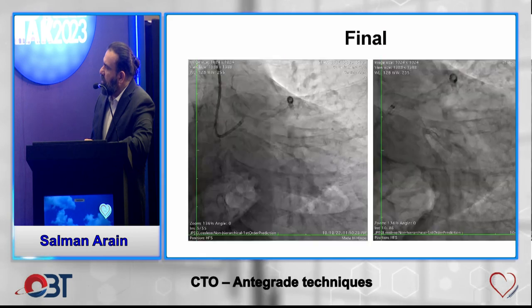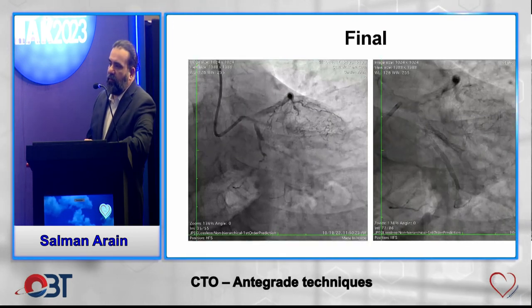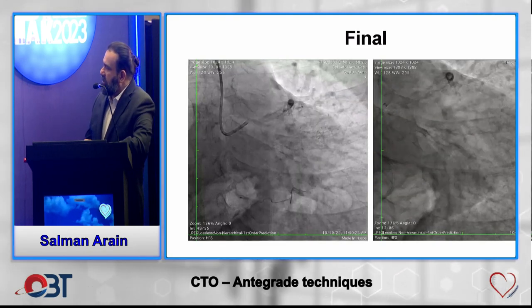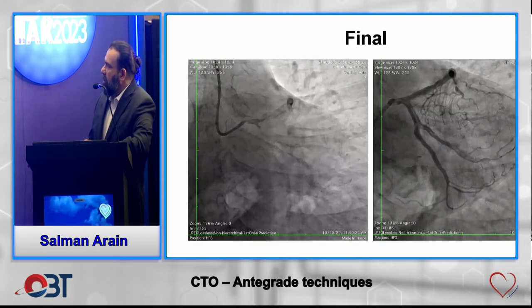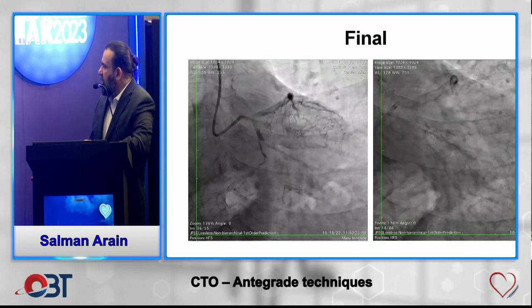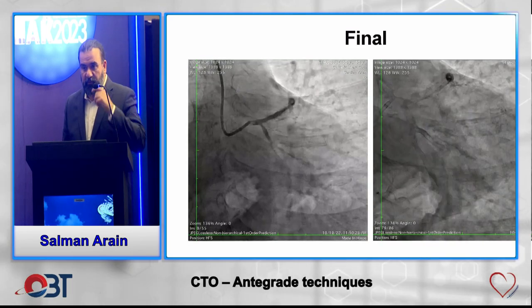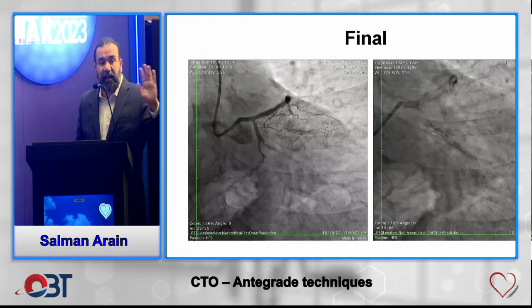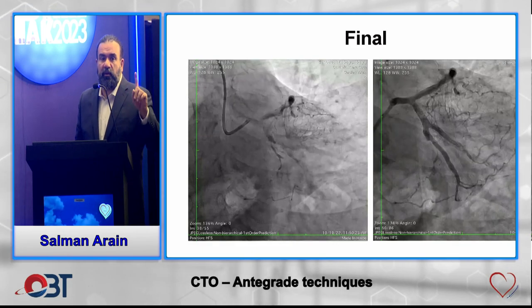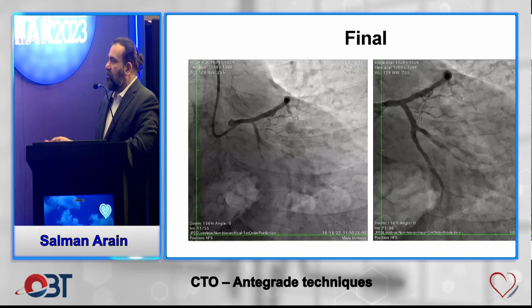In the interest of time, I'll show you what our final result was. This is the final. This is what we started off with. They wanted me to fix this, and this is what we ended up with. And this whole case, if you look here, started at 11:50 and ended at 1:16. So the whole case took about an hour and a half. A CTO which a man has had for decades, we did it in under 2 hours with a contrast load of only about 75 cc's, and he felt fantastic after this.